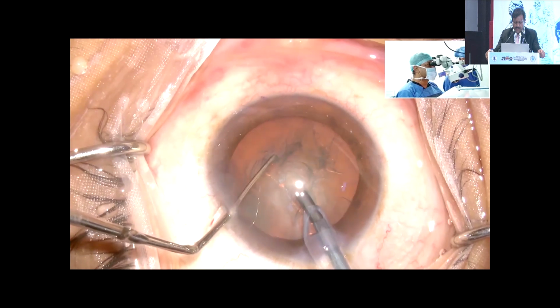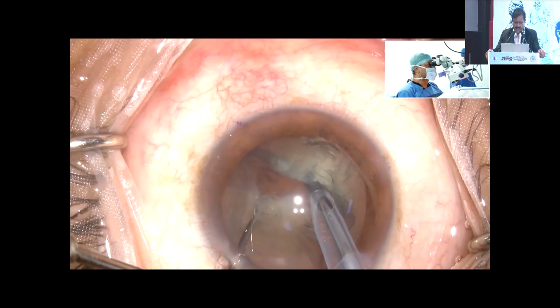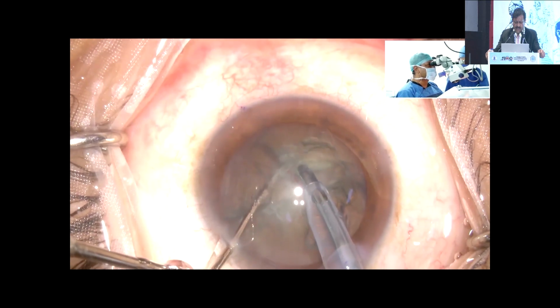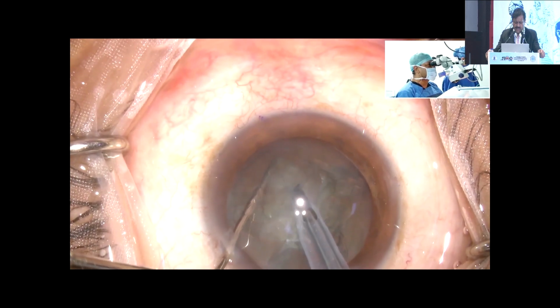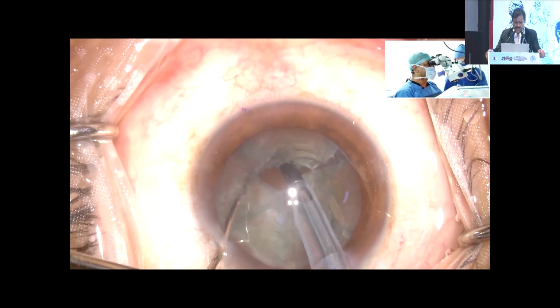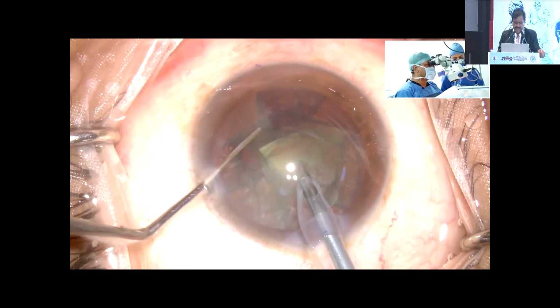So what is more important is that the right hand should always remain stable. I do a straight direct chop, and most of the times it is my left hand which is going to move, and the right hand is just to bury, hold, and the left hand does most of the separation laterally. I would try and separate all 360 degrees pieces so that the pieces can be separated, and then gently you can emulsify these pieces one by one.